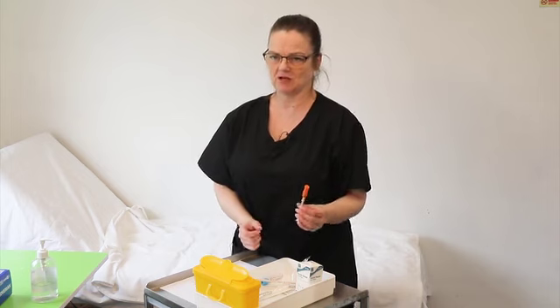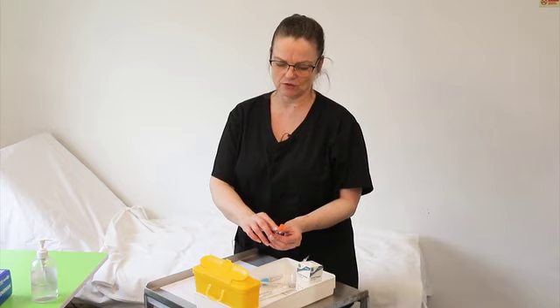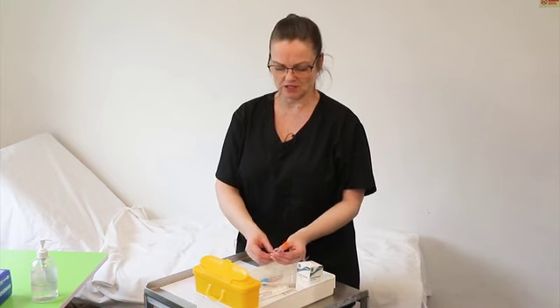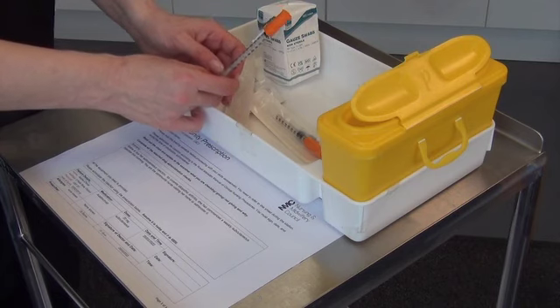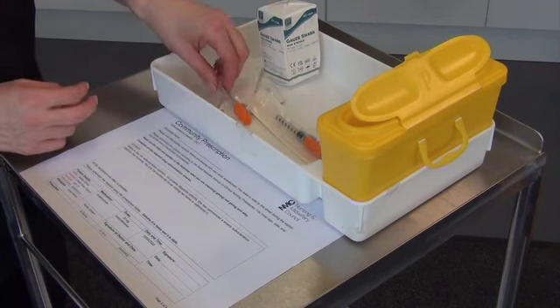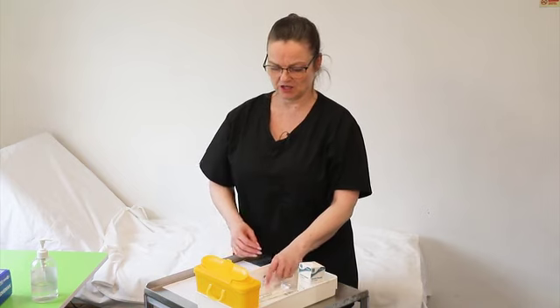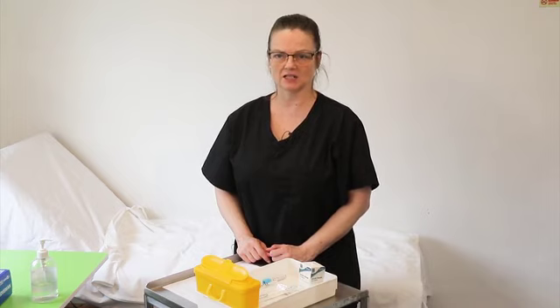If you get a 50 unit syringe for insulin, it has it all the way down just in the increments on the same side as the mark for the number. And that means that if you're not used to using these 100 unit syringes, you may not realise, and then you typically will draw up too much medication. And this is what I find when I am practicing with the nurses, and I've been doing this insulin administration for many years in the OSCE training, so I've seen this week in, week out.